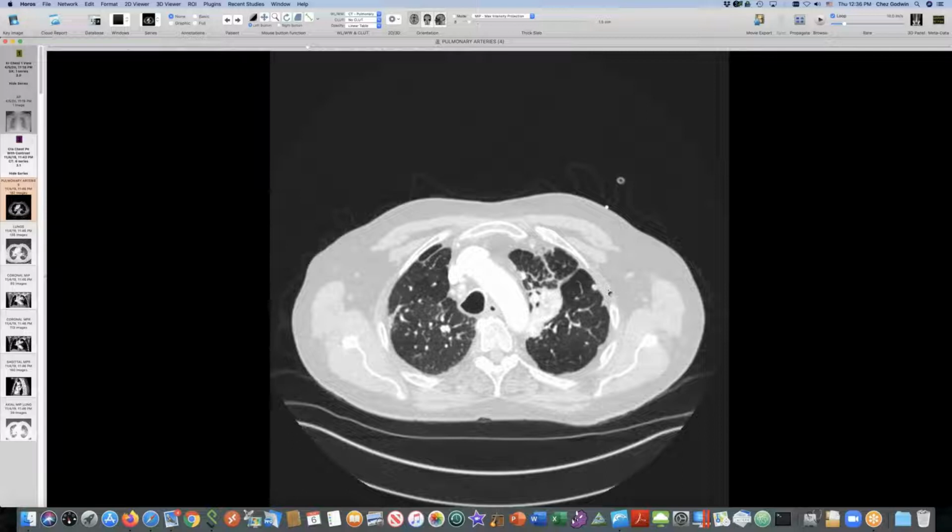Now, David, question for you. I've seen sarcoid, and I'm going to go back and look at some other cases with the pseudoplaques. Yes, I have seen a few cases of that too. But you're saying when they're calcified, that would be silicosis. Yes, I think that's right. I've seen pseudoplaque in a couple of cases of sarcoid. It's much more frequent in silica exposure. But when it's calcified, in my experience, it's always been silica. It's always been in a miner or somebody like that.